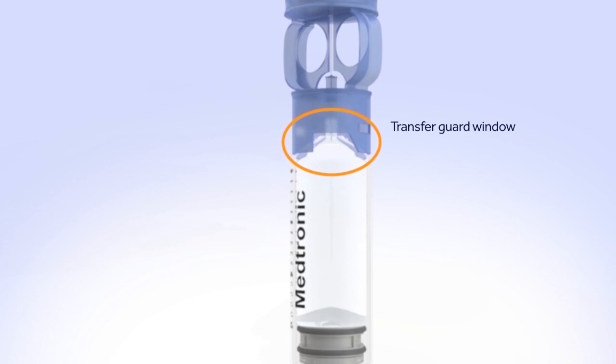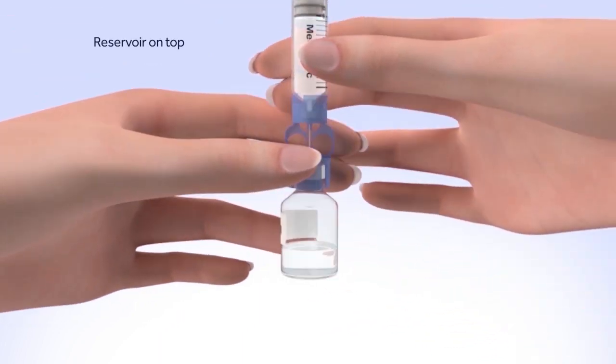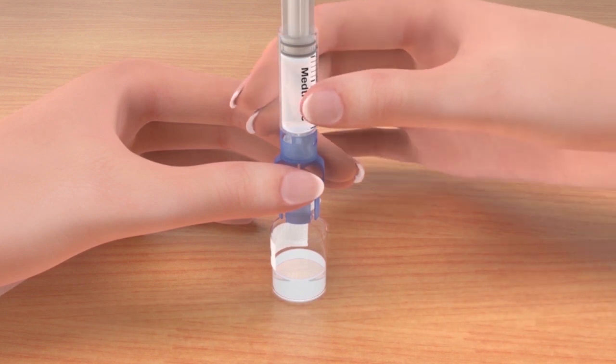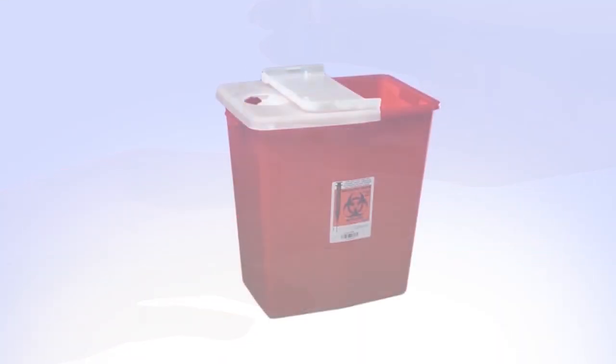Look in the window of the blue transfer guard to make sure no air bubbles remain. Any air bubbles the size of champagne bubbles are normal, so don't worry about these. To avoid getting liquid on the top of the reservoir, flip the reservoir over so the reservoir is on top. With the vial down on the table, hold the transfer guard with one hand. With your other hand, turn the reservoir counterclockwise and then pull straight up to remove it from the transfer guard. Be careful not to press on the O-rings. Disconnect the transfer guard from the vial and dispose of it properly.